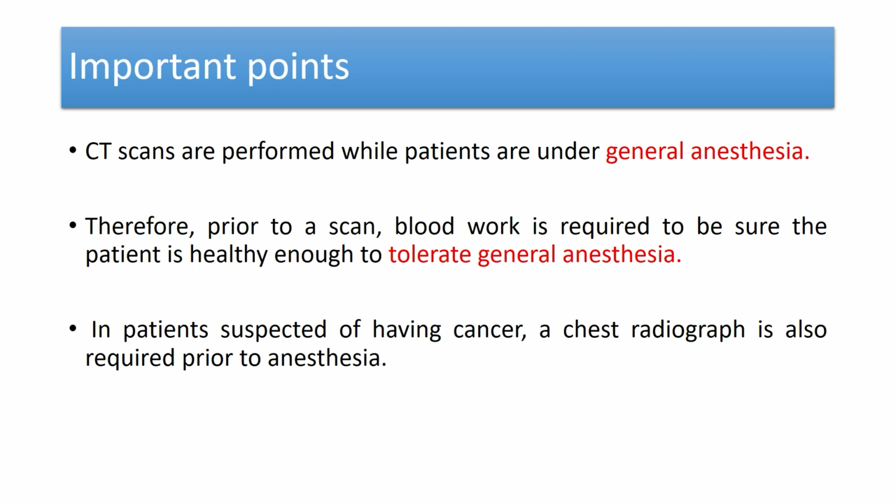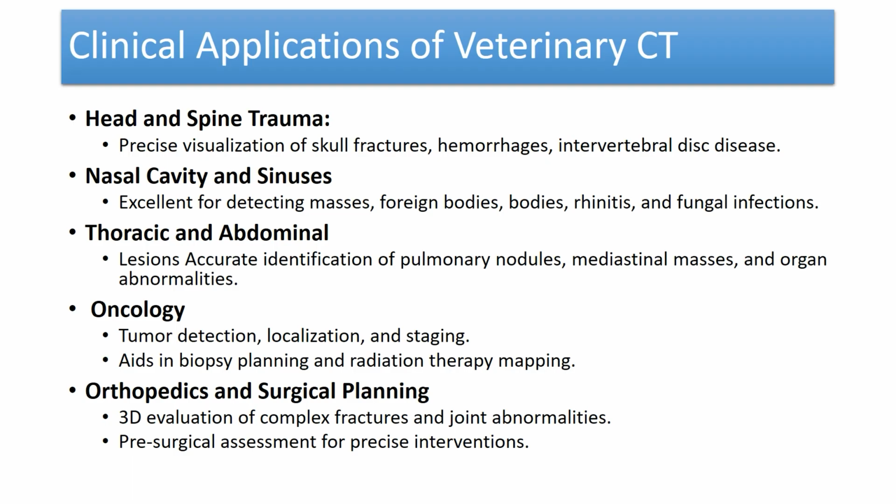Now, another important point related to the CT scan. The CT scan should be performed while the patient is under general anesthesia. Therefore, prior to the scan, blood work is required to be sure the patient is healthy enough to tolerate general anesthesia. In patients suspected of having cancer, a chest radiograph is also required prior to anesthesia.